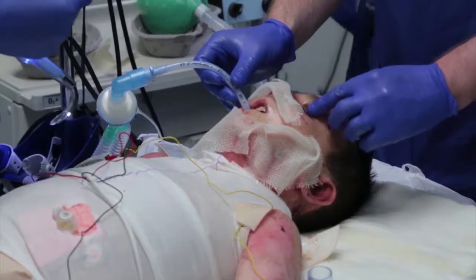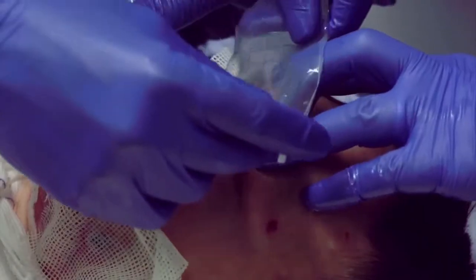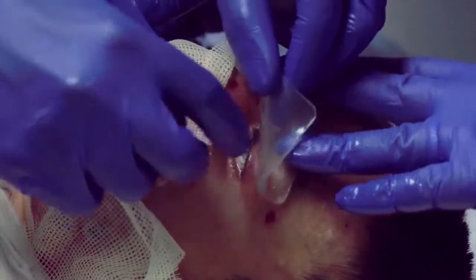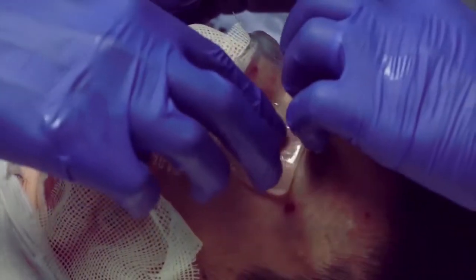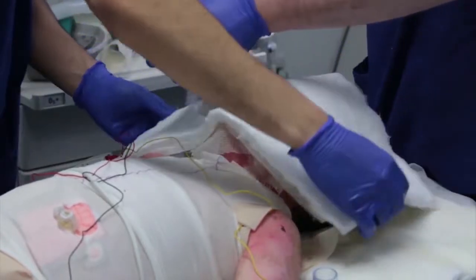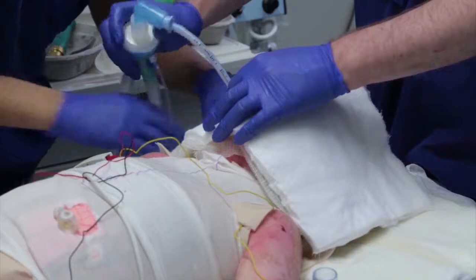Traditionally, the patient's eyes are taped shut during anaesthesia to protect the eye and prevent drying of the cornea. For EB patients, we avoid tape and use gel to protect and keep the eyes shut. The head is then wrapped in padded gauze lined with Gelinet, and the endotracheal tube secured with a tie that does not rest on the patient's face.